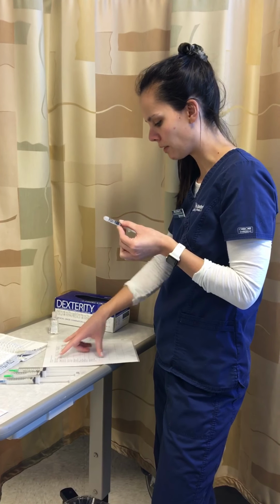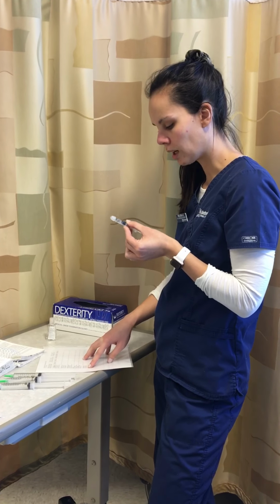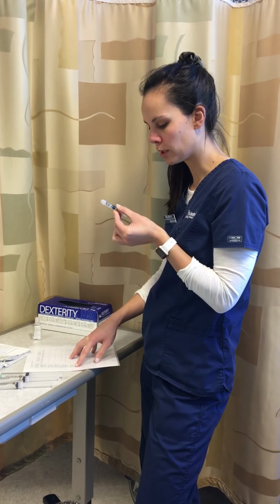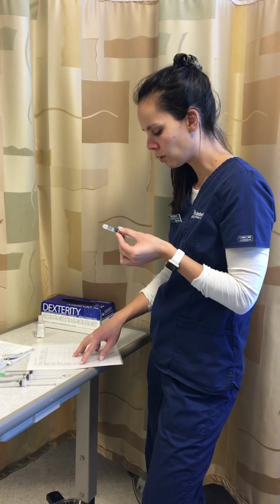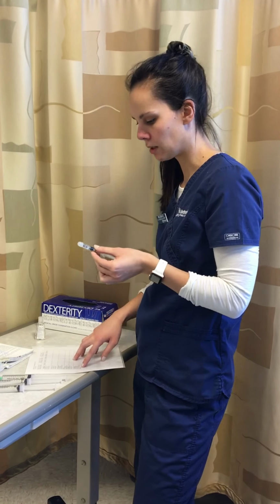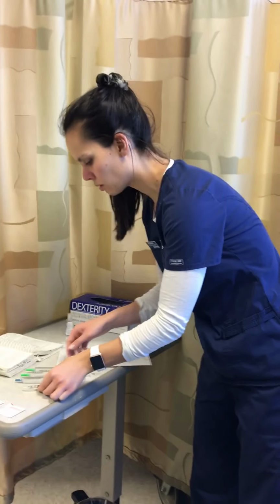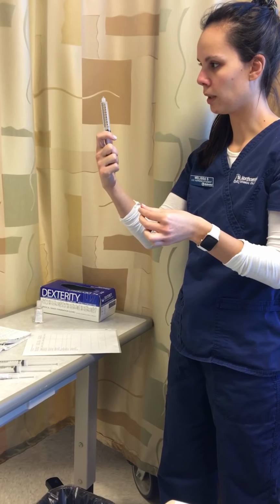And then Mary Smith, 5/18/1963, ondansetron due, 4 milligrams equal to 1.6 milliliters, IV push over 2 to 5 minutes in her PICC line every 4 hours as needed. Alright, so then I'll prime my flushes right away.